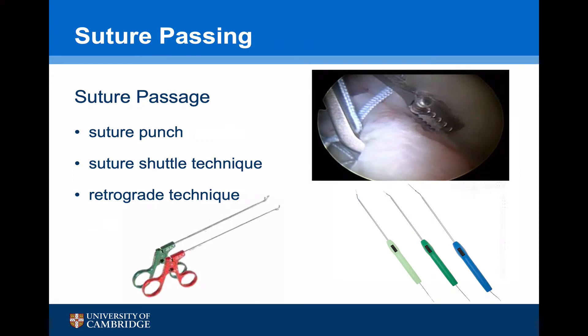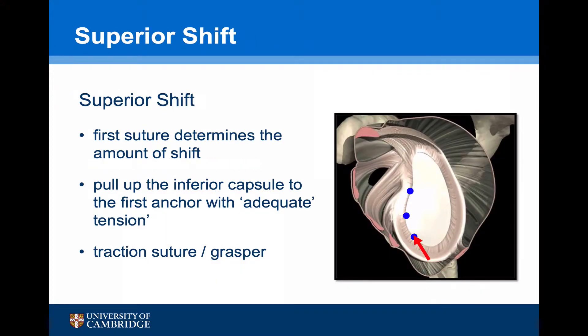There are a number of ways of passing the suture through the capsule: you can use a suture or labral punch, a suture shuttle technique, or a retrograde technique using instruments such as a Scorpion. Today I'm going to be using a suture shuttle technique. The essence of a successful Bankart repair is obtaining a sufficient superior shift to reconstruct the anterior inferior glenohumeral ligament. The first suture is the biggest determinant of this shift — it's important to pull the inferior capsule right up to the first anchor with maximum tension. This can sometimes be helped using a traction suture or a grasper, but is ultimately down to experience and skill.